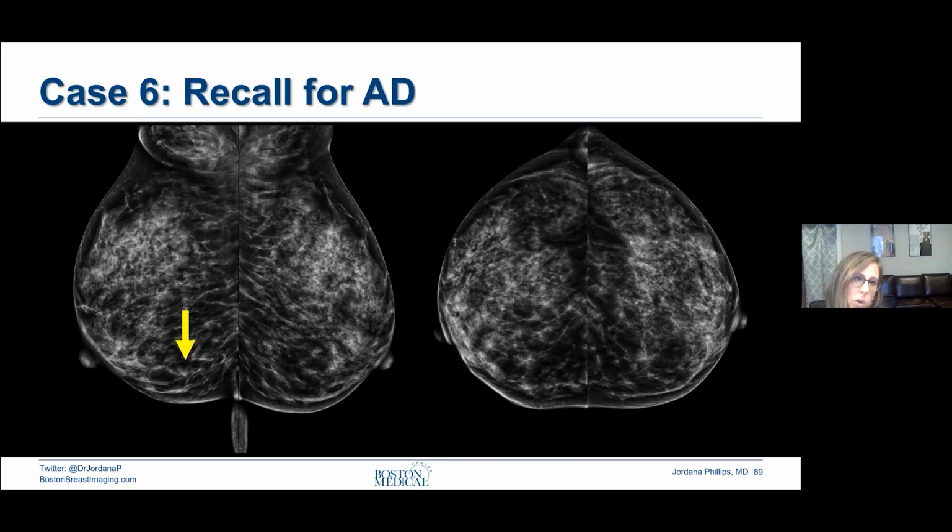So the contrast mammogram helps us decide. It gives more information to help triage. Is this something to worry about or not? And then on the flip side, if it's one of those obvious areas of architectural distortion, it really helps for staging. So this is an example of subtle distortion. Is this real? Is it not real? We bring her back and look at that.